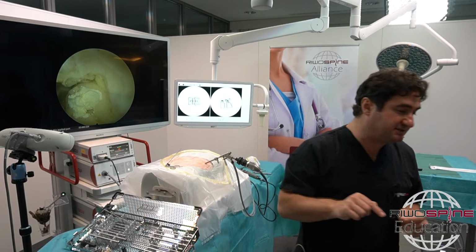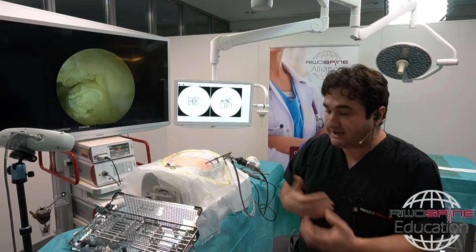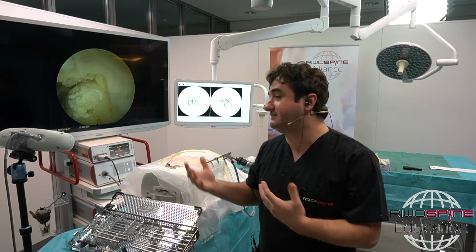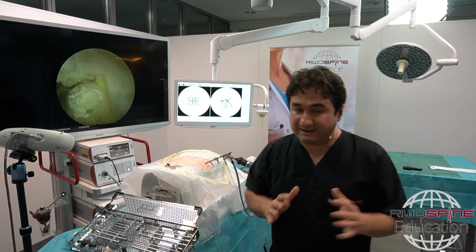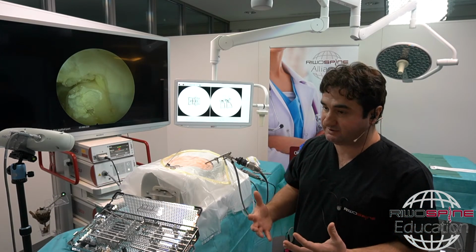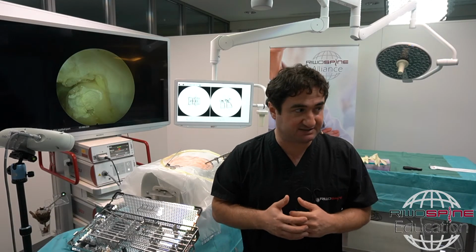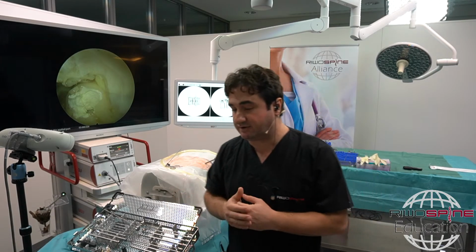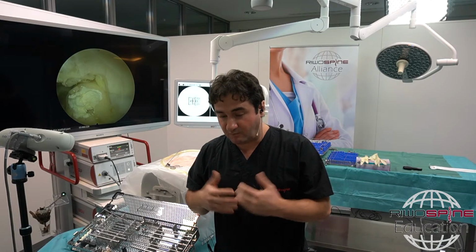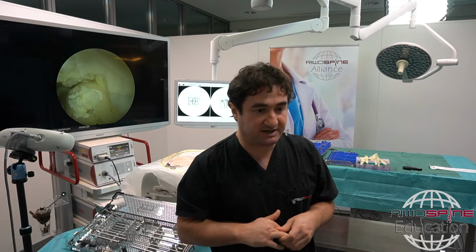If the question is, and we get this question several times, shall I use my regular bipolar, for example? I never recommend this, because we need to use the high frequency to protect the neural structures. If you use your conventional bipolar, then you can easily damage the neural structures during the operation.